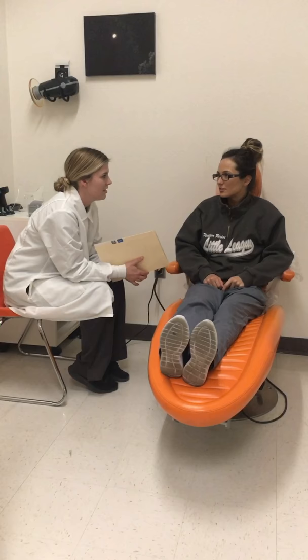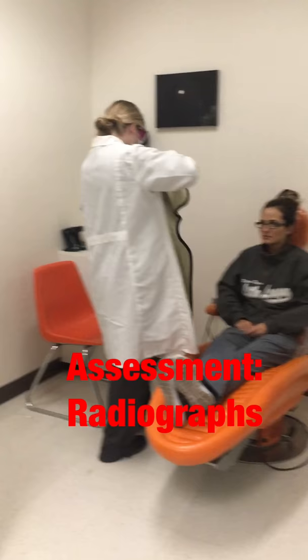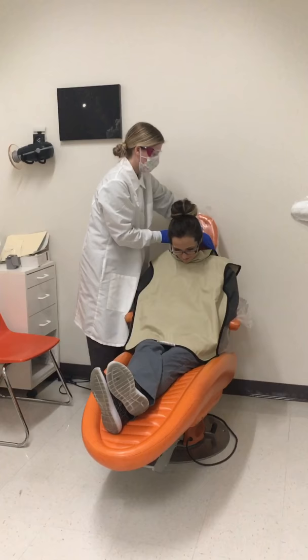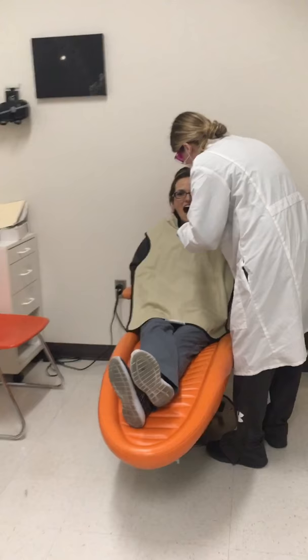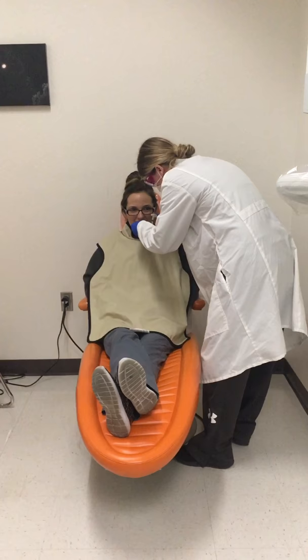We'll take some x-rays first thing and see what's going on, and then we'll get you back into the clinic. We're going to take four bitewings today. Bitewings take interproximal pictures of your teeth to see if you have any active cavities — go ahead and bite.